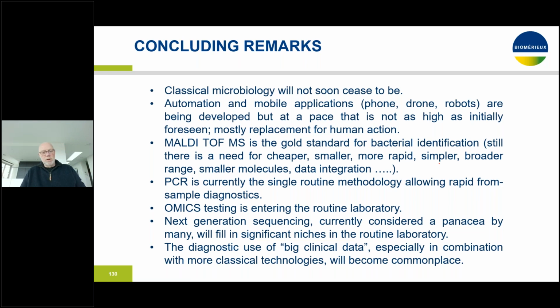and that might also include the analysis of smaller molecules, and then this work done by Caroline and Adrian Agley in Switzerland, where data is being integrated from diverse perspectives. I think that is a development that we should very carefully monitor over years to come. Still, mass spec is not the only diagnostic gold standard technology.